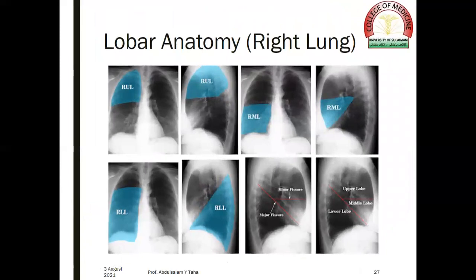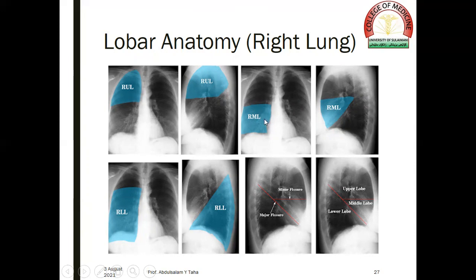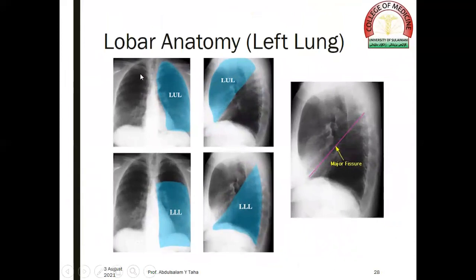We need to know the location of different lobes on the plain chest radiograph, because this knowledge will help us to localize lesions or abnormalities. The right upper lobe takes a certain area on the PA view and on the lateral view, as does the right middle lobe and right lower lobe. Regarding the left lung, the left upper lobe occupies its region in the PA and lateral view, and the left lower lobe in the PA and lateral radiograph. The division is made by the oblique or major fissure.